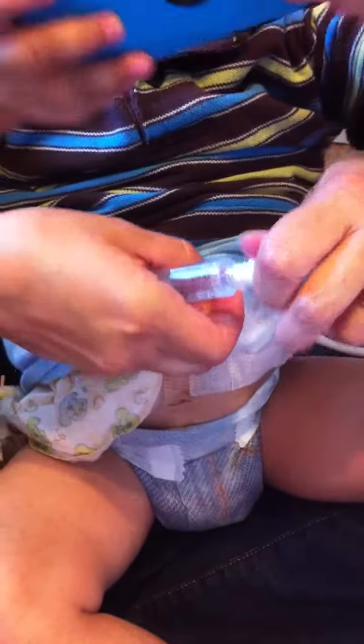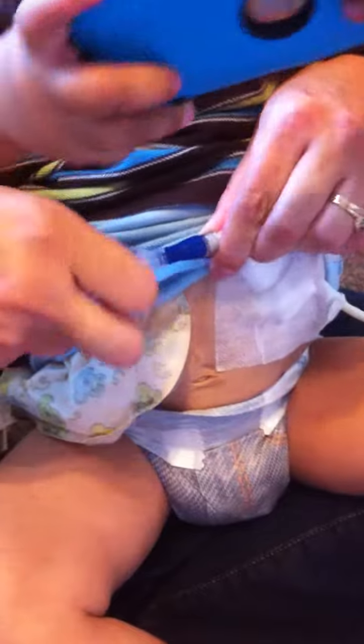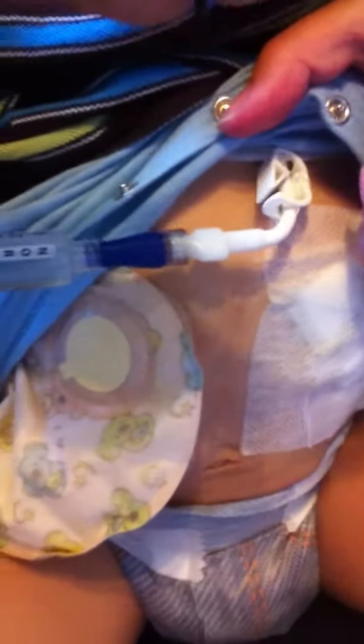Then flush with five mls. Unclamp his Broviac, right here. My tape made this difficult.